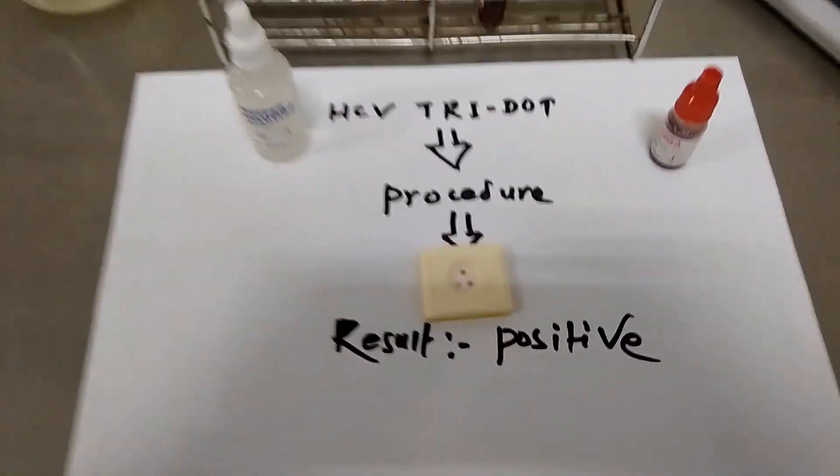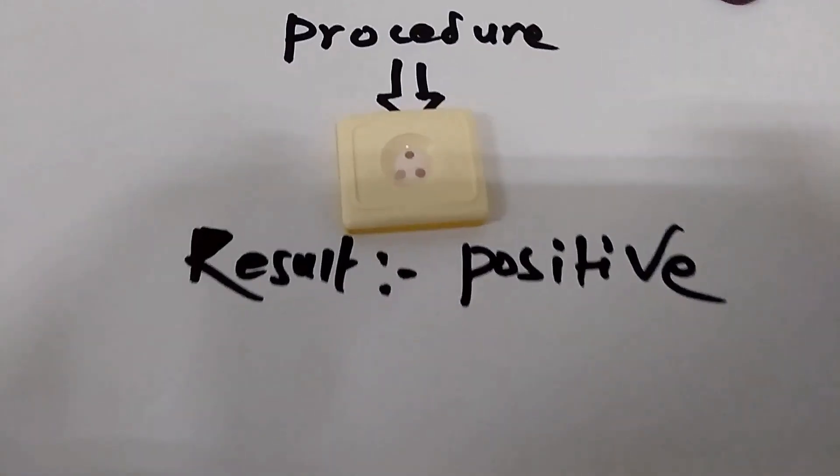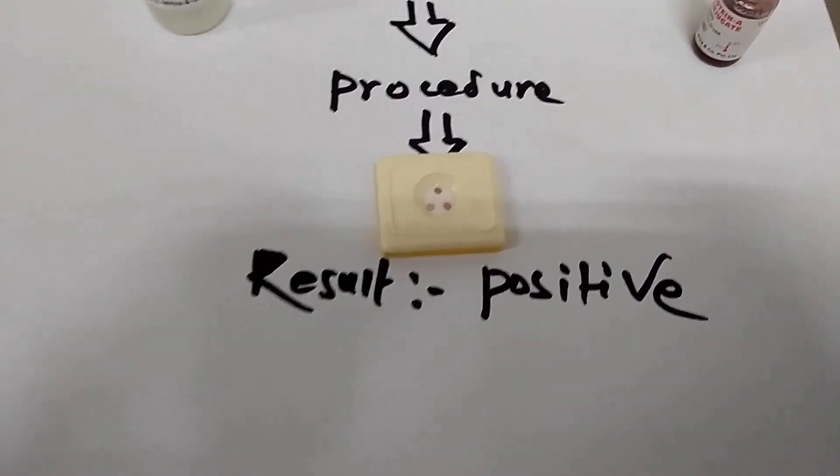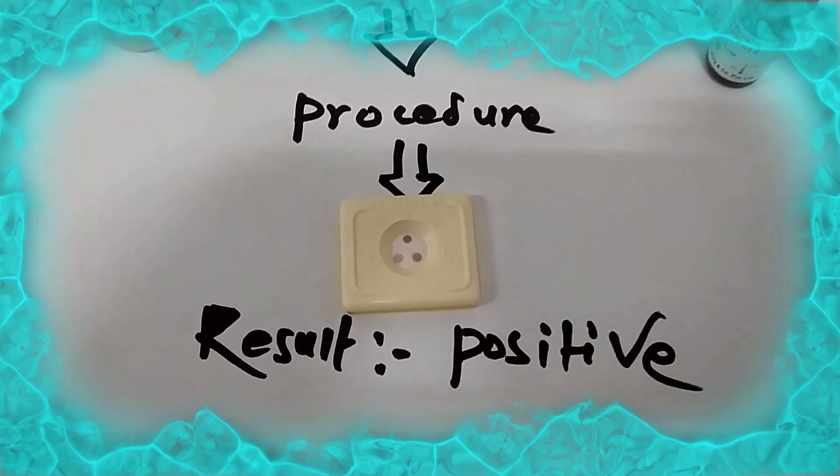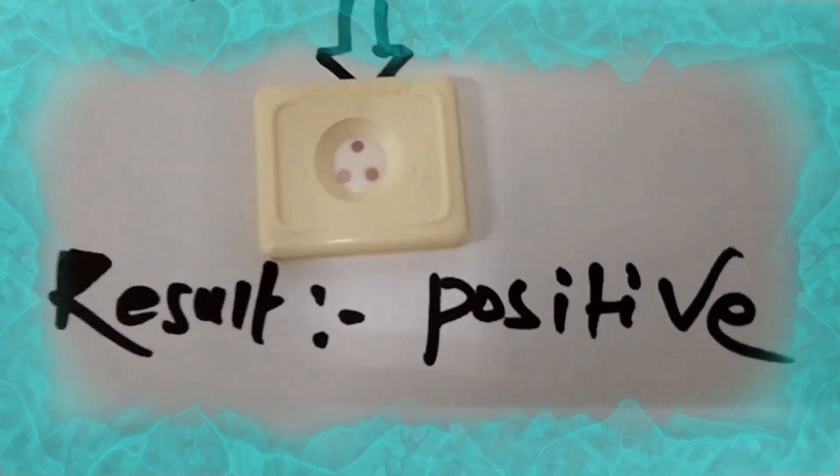Any pink dot plus control dot, test is positive. So here we can see three dots on device. It means that the result is positive.